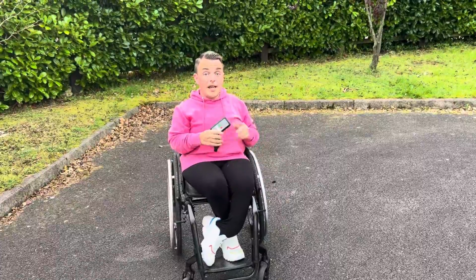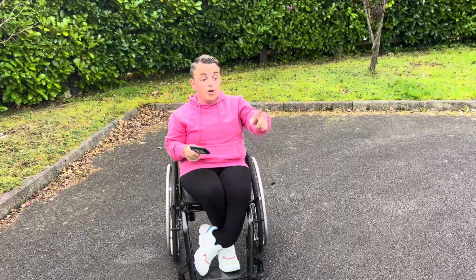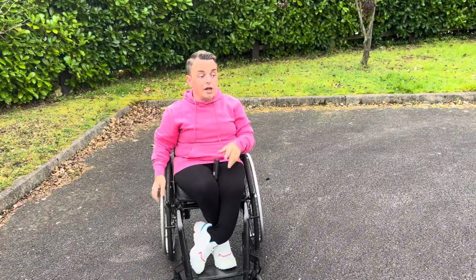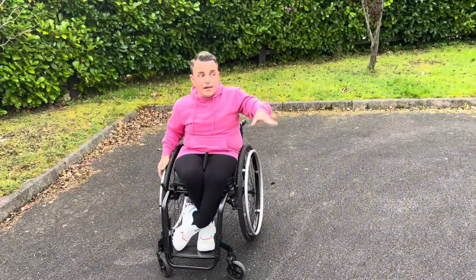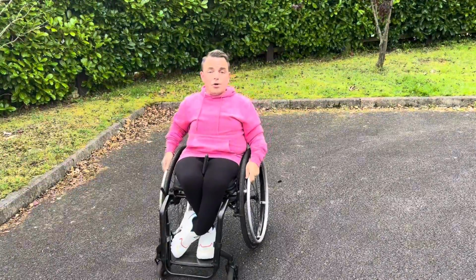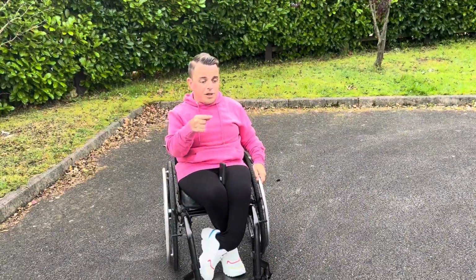And what I will say is if the battery does go in this lift fob, then you've also got one attached to the actual lift itself, which is what I'm going to be using today. So now I'm going to roll onto the lift, then roll into the back of the van, and you will see once I'm in the van how simple it is. I would also like to mention this has got something called an internal transfer, but I'll explain more about what an internal transfer is once I'm in.